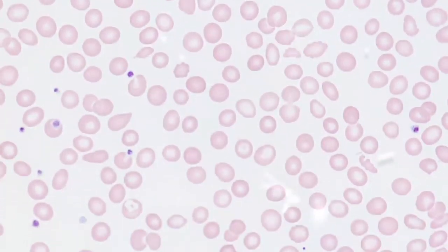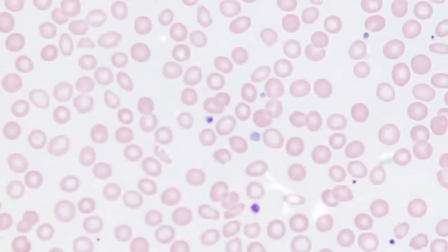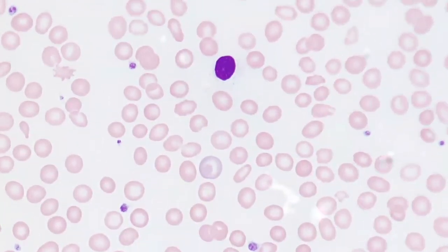Here we can see some target-shaped cells, but you'll notice that many of these cells have increased central pallor. Typically in the red cell indices, the MCV, MCH, and MCHC are all decreased, and the RDW is increased.